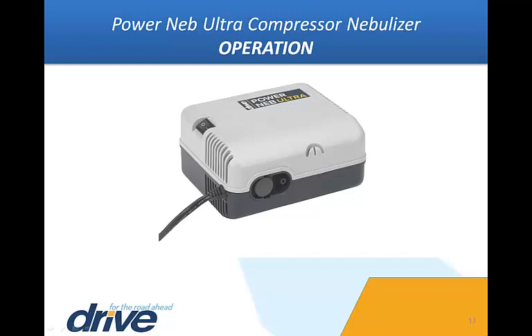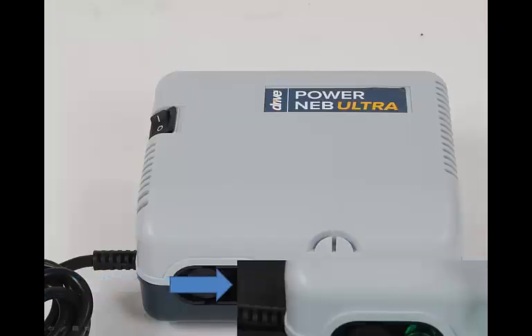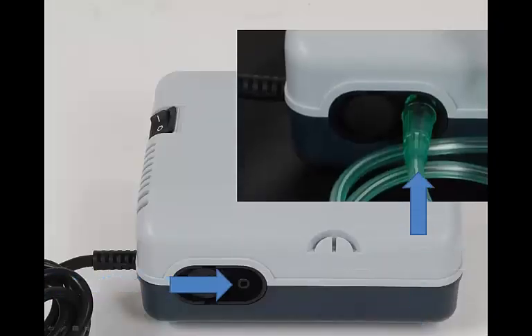Place the power nebulizer on a flat, stable surface where you can easily reach the controls when seated. Do not use this device on the floor. With the power nebulizer switch in the off position, plug the power cord into an appropriate electrical wall outlet. Connect one end of the tubing to the compressor air outlet connector.